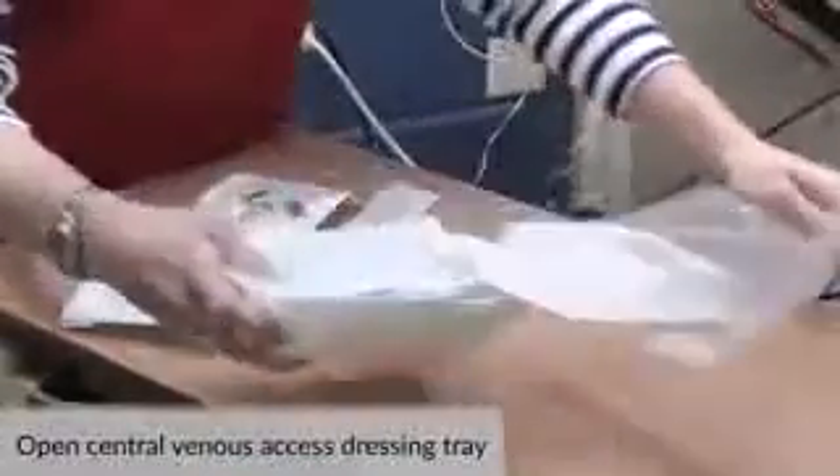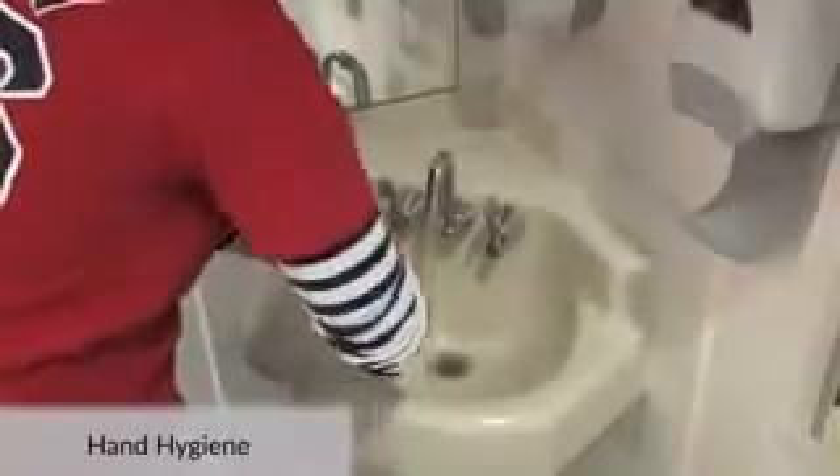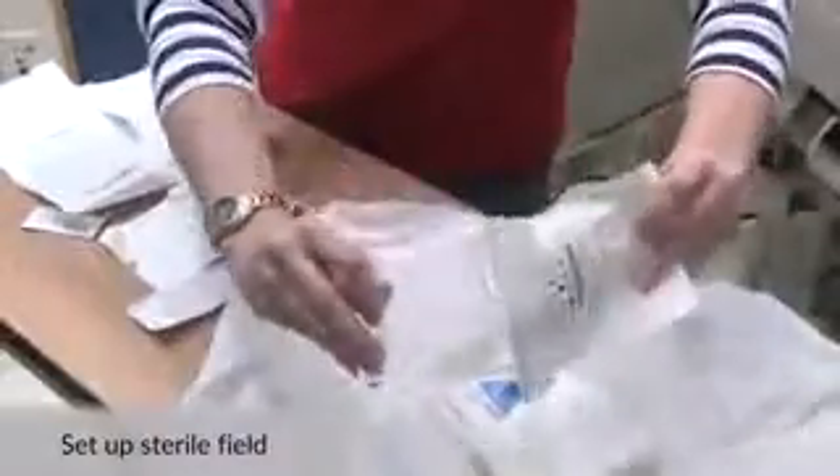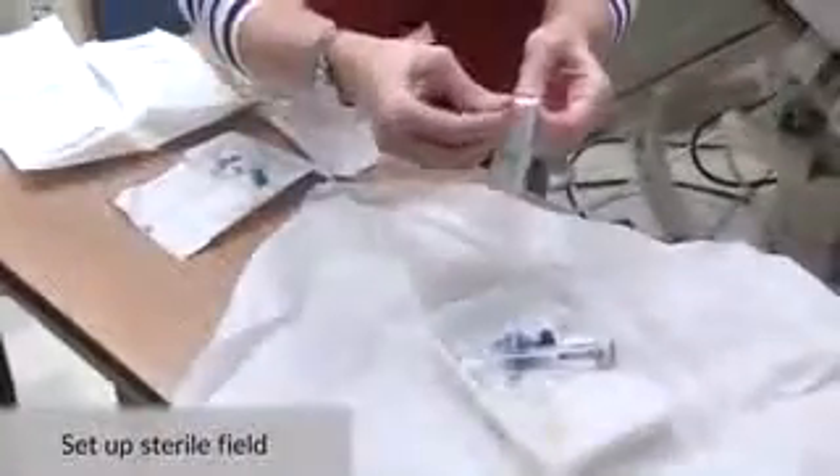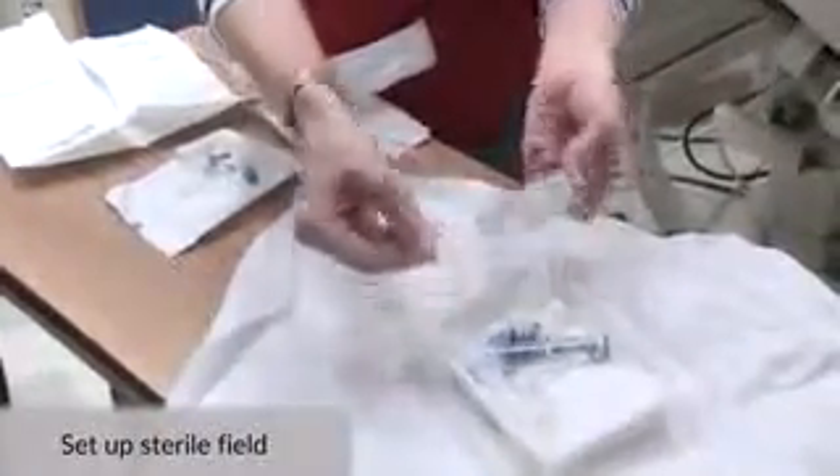Open the central venous access dressing tray and don a mask. Perform hand hygiene including a 30-second hand wash. Open your sterile field. Open your sterile non-coring needle set, 10 ml sterile normal saline syringe, and needleless connector onto the sterile field.